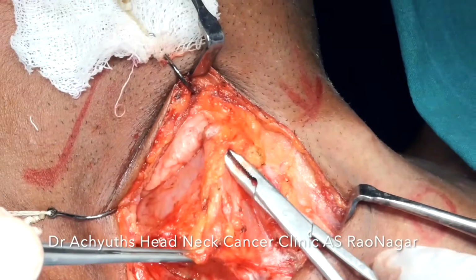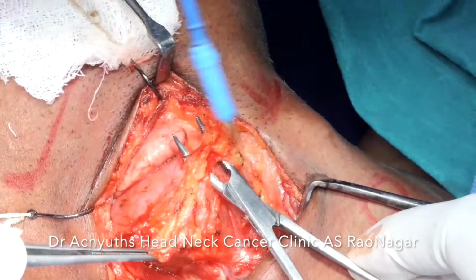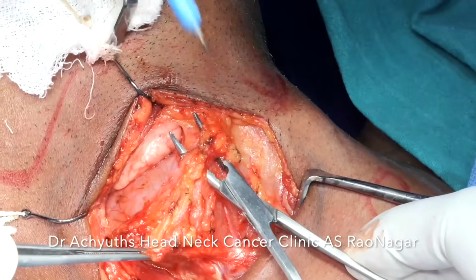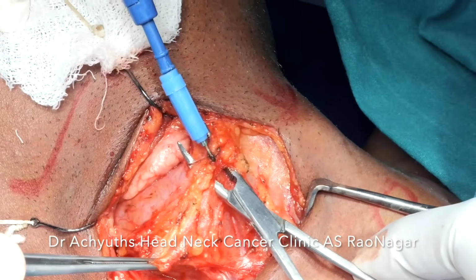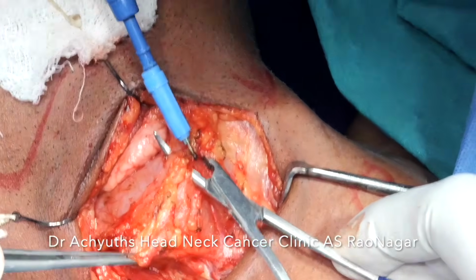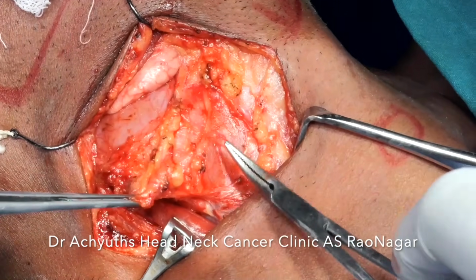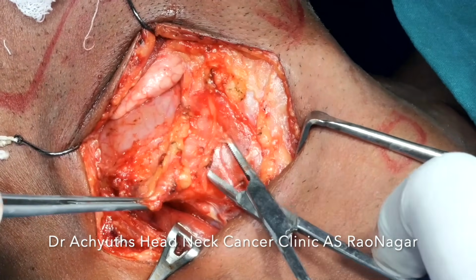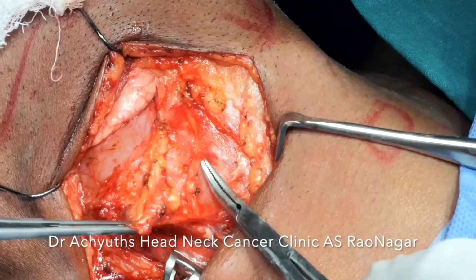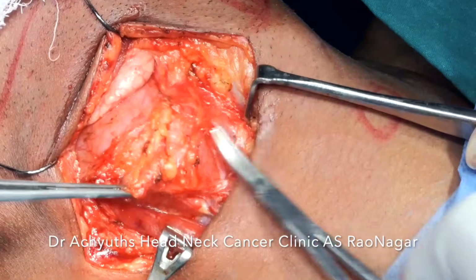So a very careful dissection with the help of mosquito, or some people may do it right away with the cautery itself, but I was a little skeptical and I was more confident and comfortable initially dividing the fascia with the mosquito only. So I was dividing the fascia, lifting it so that the underlying cyst wall is maintained, and asking the assistant to cut.